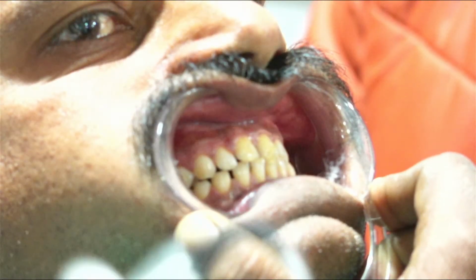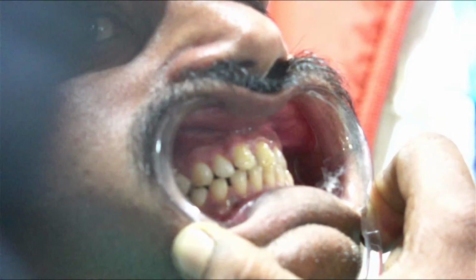Facial aesthetics, you need very shallow settings. You can do it for acne vulgaris. Put a drop of dye and you can do that, but not on the face. Derma and depigmentation, those again I've got different settings.